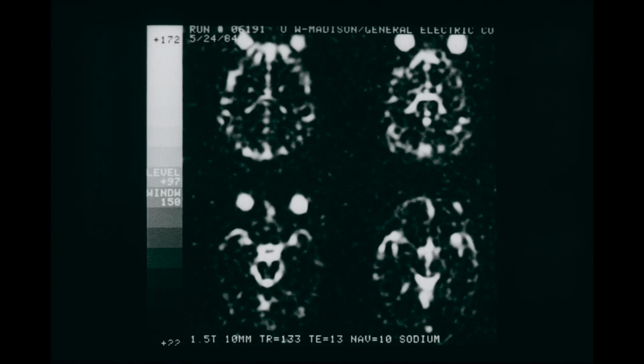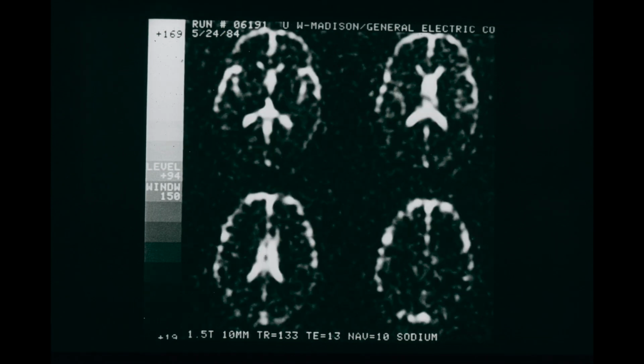This is a sodium image. This is collected in a 3D acquisition, courtesy of the University of Wisconsin-Madison. This is 4 images, and the other set of 4 that were acquired. This took roughly 15 minutes to acquire in a 3D acquisition. Because we don't have very much sodium in the body and the sensitivity is low, the spatial resolution is set low, so we have much higher signal to noise. So typically these are on the order of a 1 centimeter or so spatial resolution.